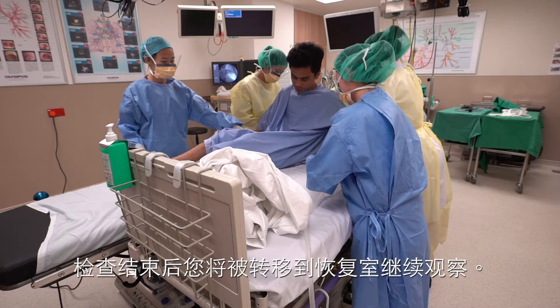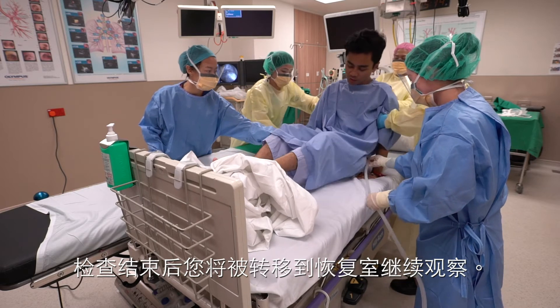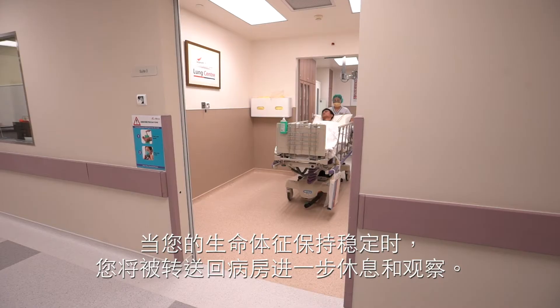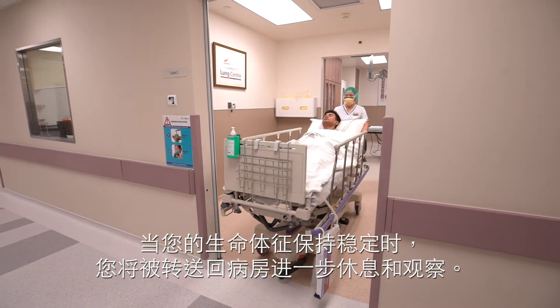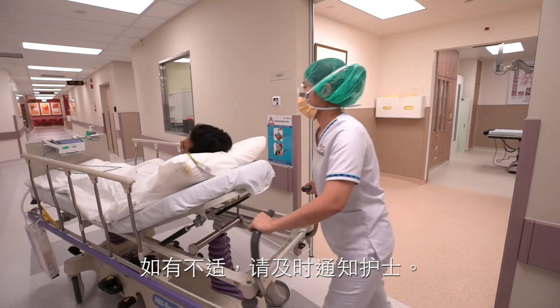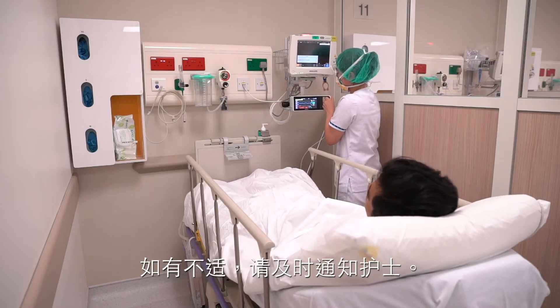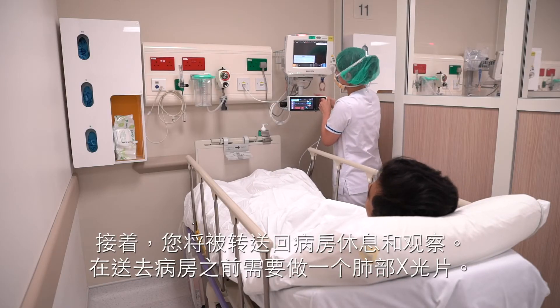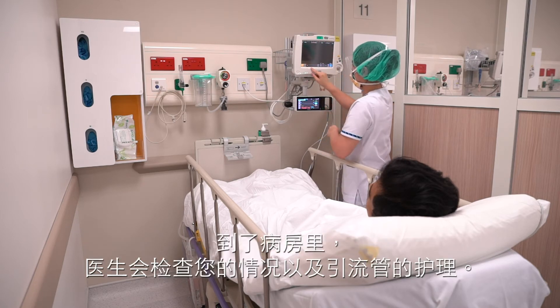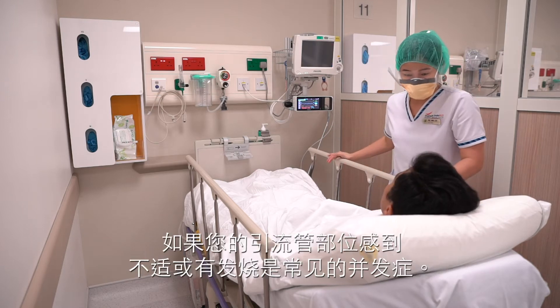Once the thoracoscopy is completed, you will be transferred to the recovery area for monitoring. You will then be transferred back to the ward for further rest and observation. Should you feel unwell, please inform the nurses. A chest X-ray may be performed on your way up to the ward.